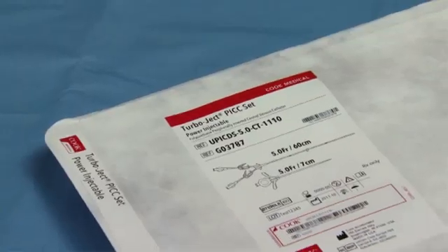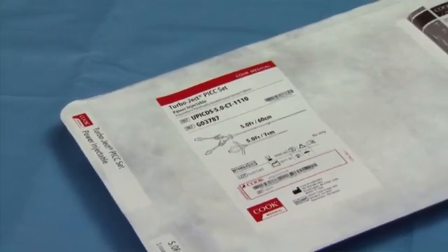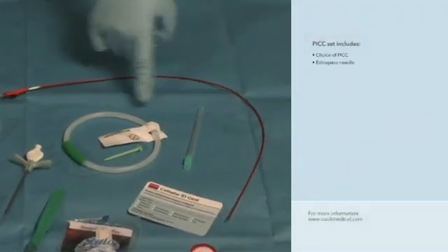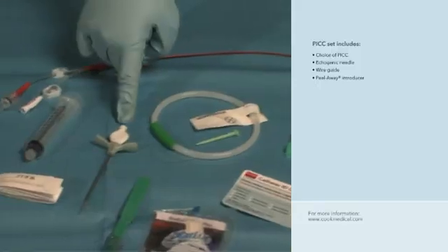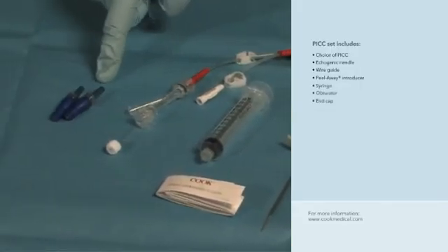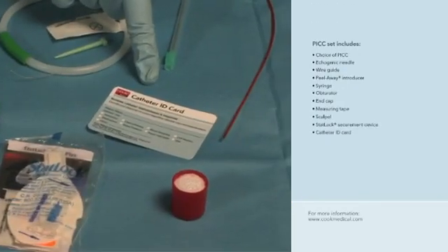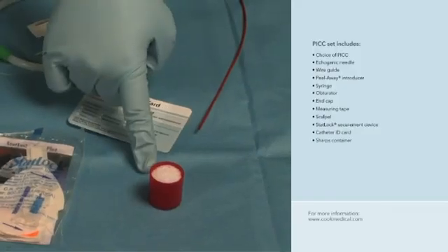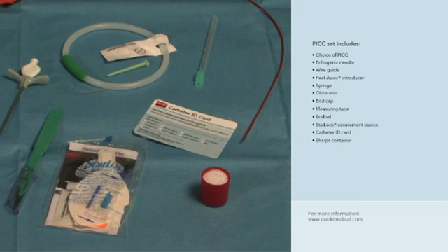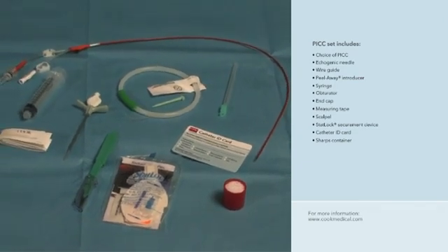Most PICCs come in sets that include all components required to complete the insertion process. The Turboject set includes a choice of PICC, echogenic needle, wire guide, peel-away introducer, syringe, obturator, end cap, measuring tape, scalpel, stat lock securement device, catheter ID card, and needle disposal container. The supplies are arranged in a sterile, organized fashion for easy reach and access, keeping items toward the center of the sterile field.